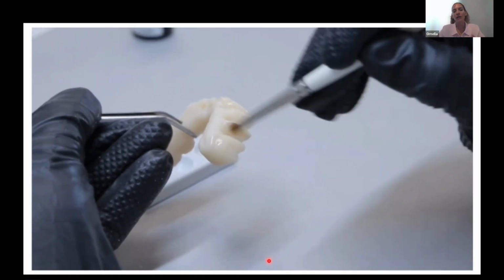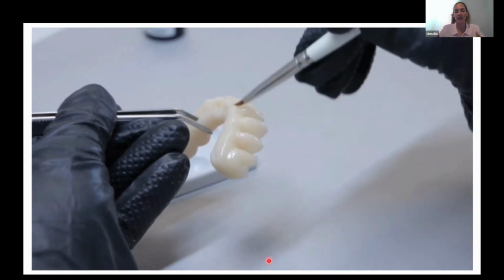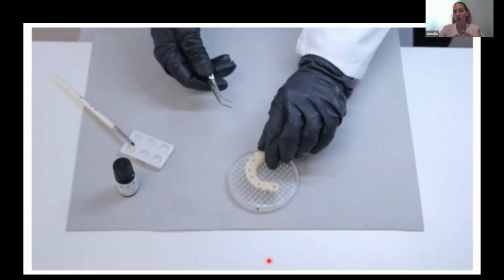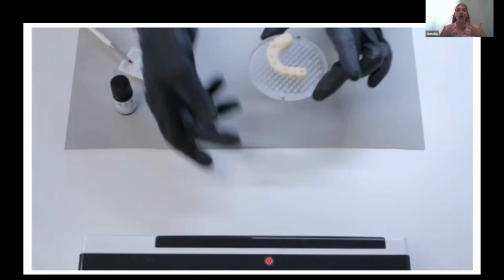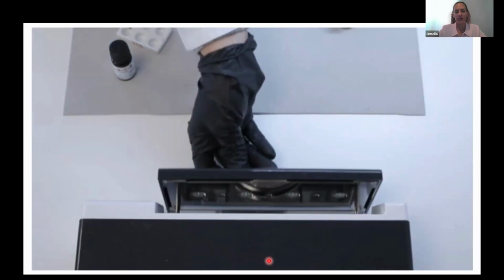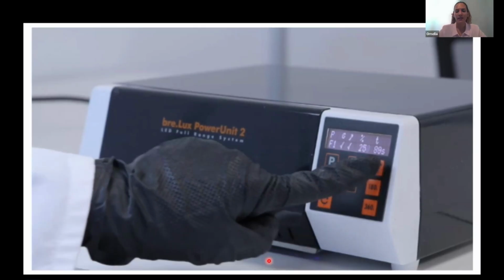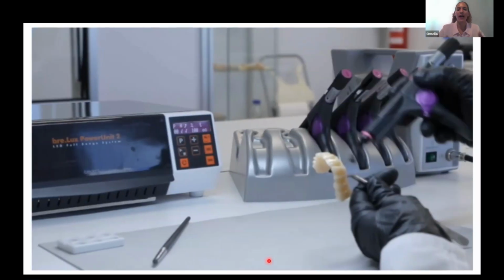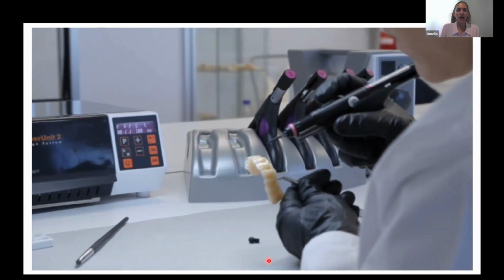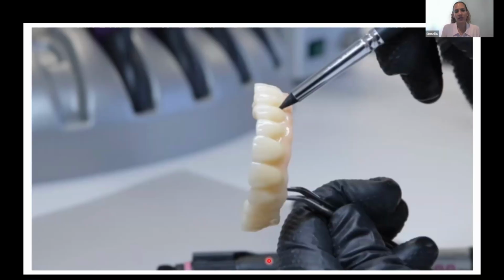Normally, all the companies on the market that provide aesthetic composite or glazing or any staining, they have their own adhesive before starting the characterization. It's important to put the adhesive on the lamp, because this way we are going to activate it, okay? Now we start putting the composite. In this case, we are adhering the pink gingiva.